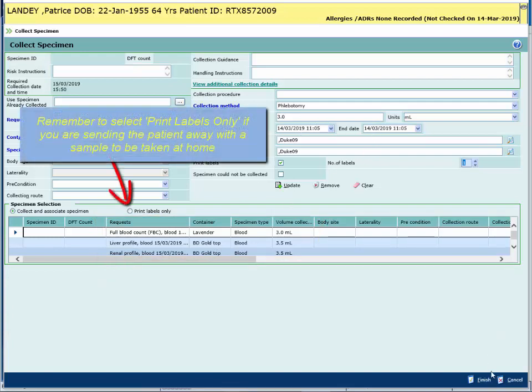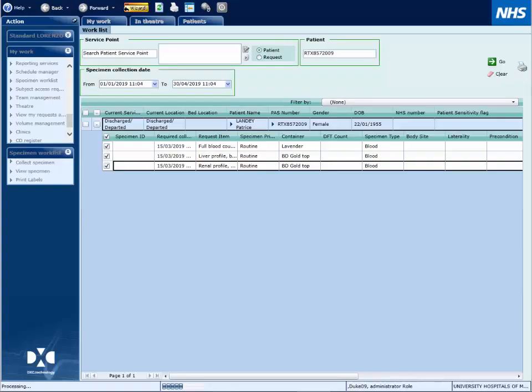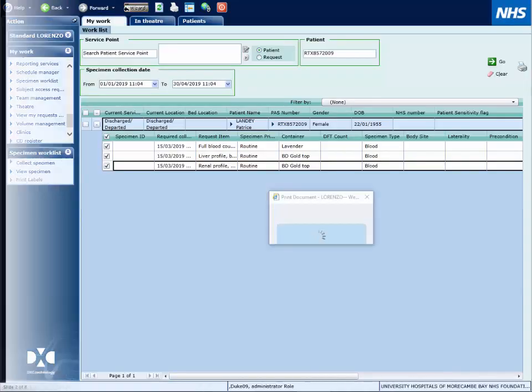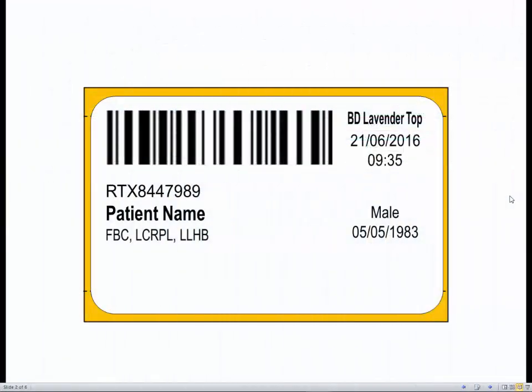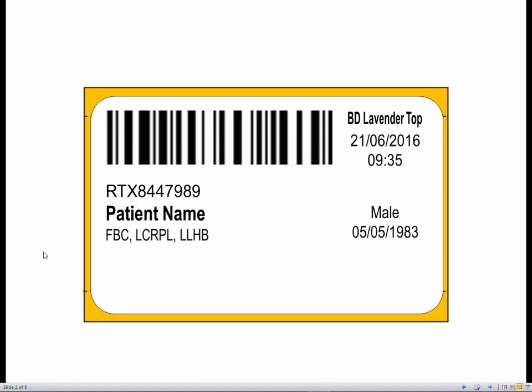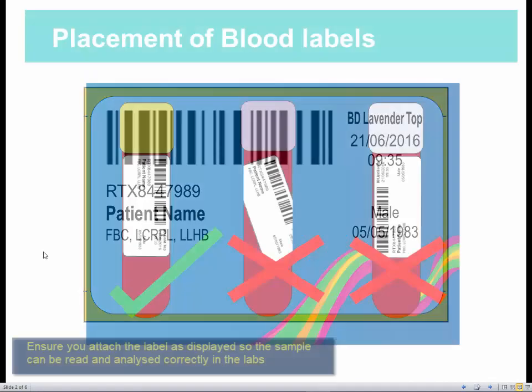Check the date and time and click Finish to print your stickers. The stickers will display the patient details, any blood tests for that sample, and also the colour top of the sample it needs to be placed on.